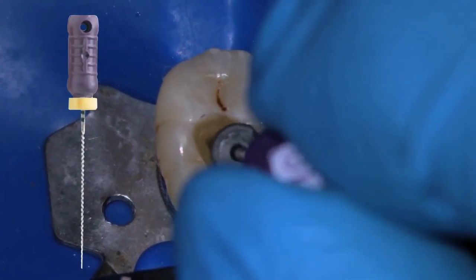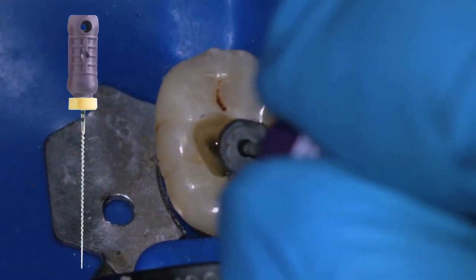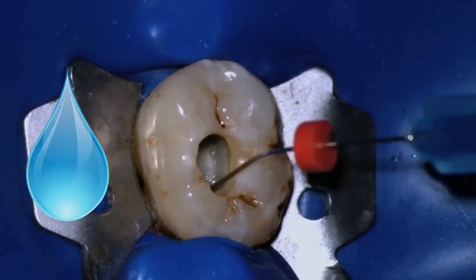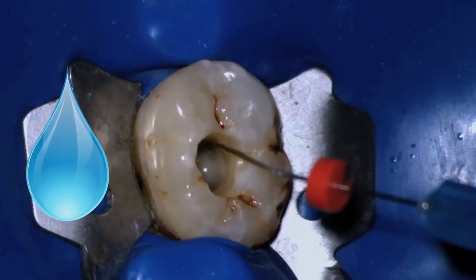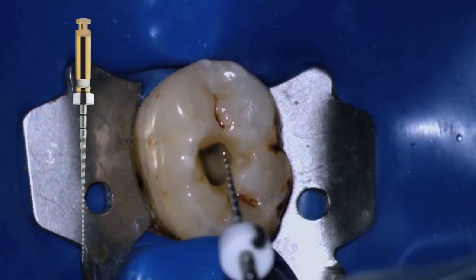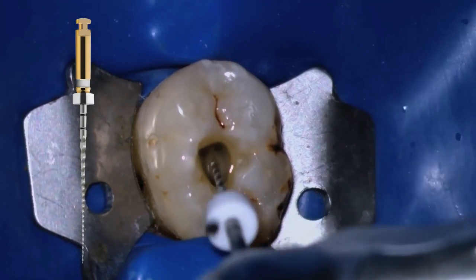Once we ascertain that patency, we will need to create that glide path with the ProGlider rotary instrument. We are irrigating here, and once again, that pulp chamber has to be flooded, always flooded with the chemicals that we use. In this case it is sodium hypochlorite. And after we have established the working length, we create the glide path.